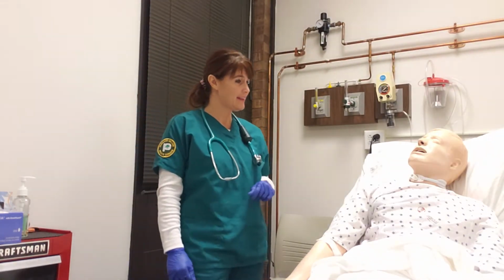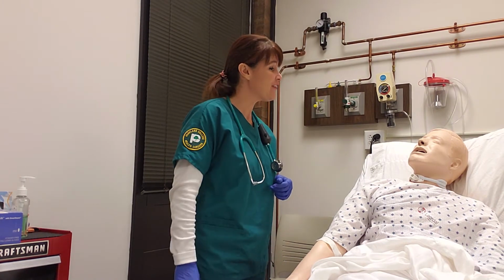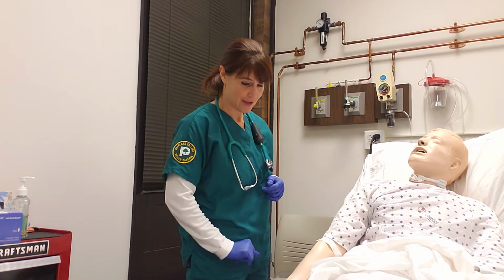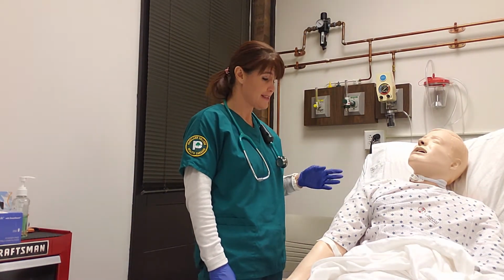Hello, my name is Amanda. I'm a respiratory therapy student. Would you please verify your name and date of birth for me? Okay, thank you, Mr. Wilson. All right, first thing I want to do is get your pulse and your respiratory rate.